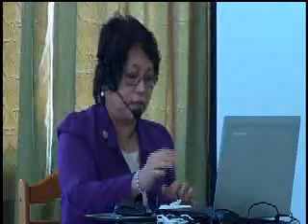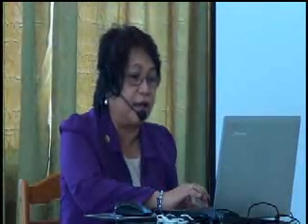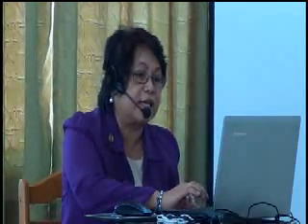As you will see later on in my other slides, there are different forms of antibody. I would like to point this out on the lower part. If you can see the high specificity, you have the lock and the key. So the interaction of the antigen and the antibody is just like a key and a lock. If your key is not specific to your lock, it does not open, then that means it's negative. The same thing with this.